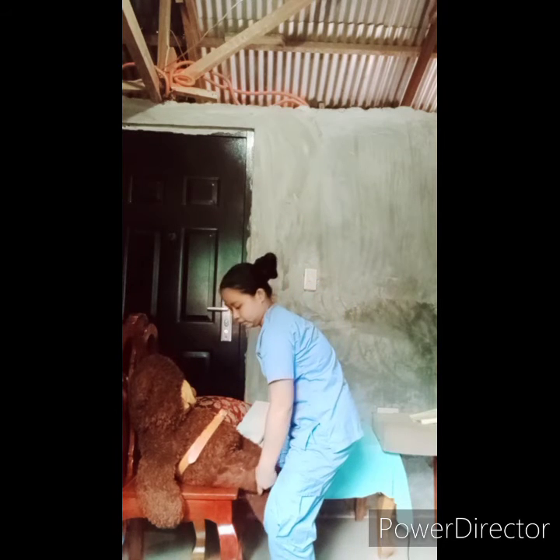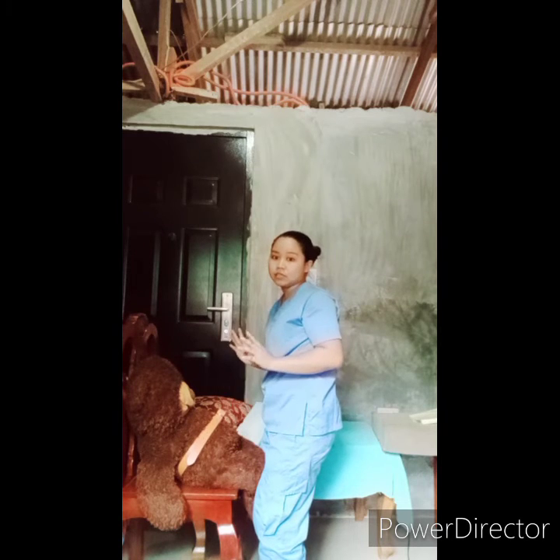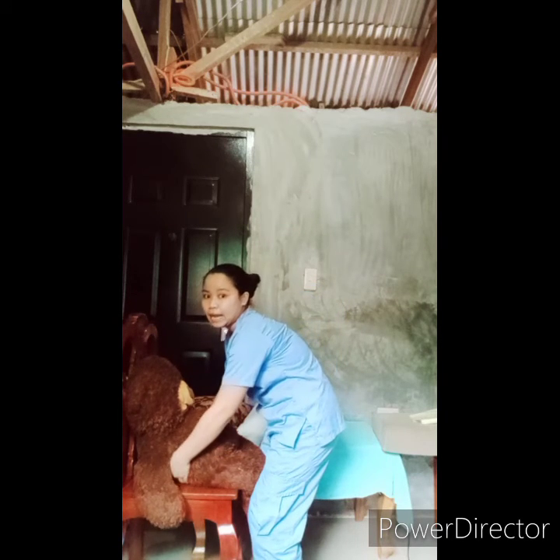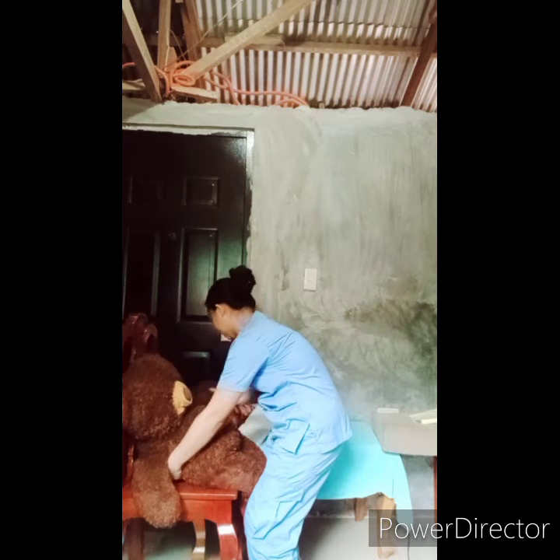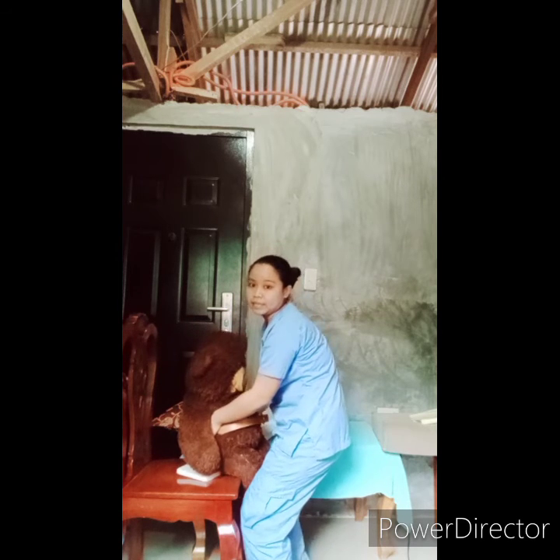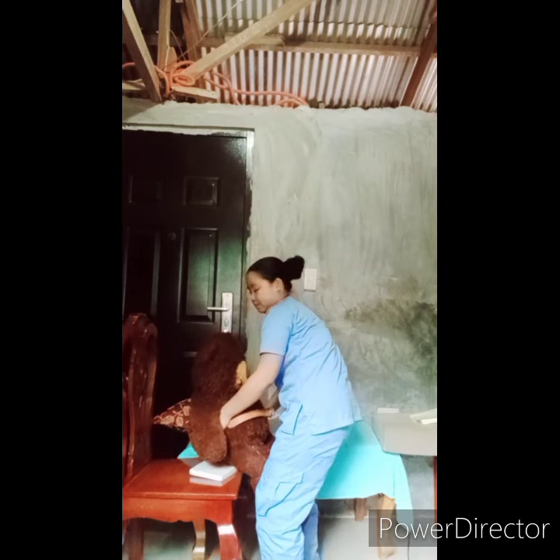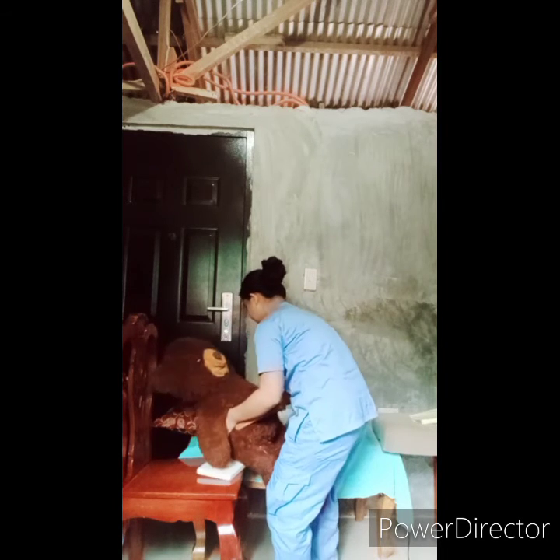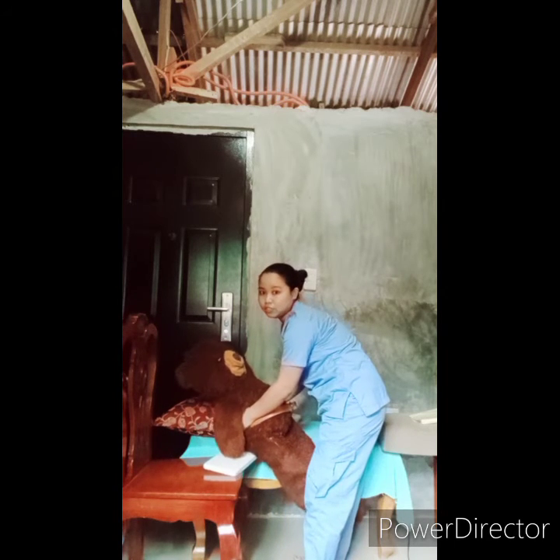Then next is let's place our own leg outside the patient's leg. Let's ensure that the patient's feet are on the floor and grasp the transfer belt. Have the patient place hands on the slide board or mattress. And then next, let's bend our knees. Have the patient use the arms to slide onto the bed. Then assist as needed. Then next, have the patient sit on the edge of the bed.